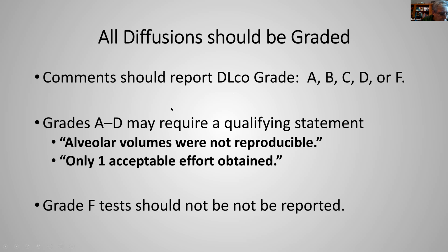When I started instructing everyone down there and had the techs do it routinely, it took a little while. It took a few weeks and a couple of months of doing that. But when you made them start grading themselves and putting that on the reports, all of a sudden, when we looked at the data a month after that, we found that over 90% of our diffusions were grade A. They were meeting the criteria.